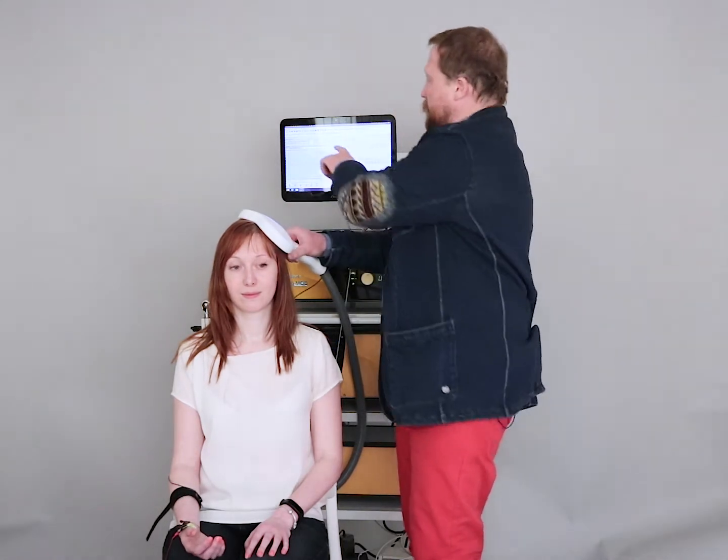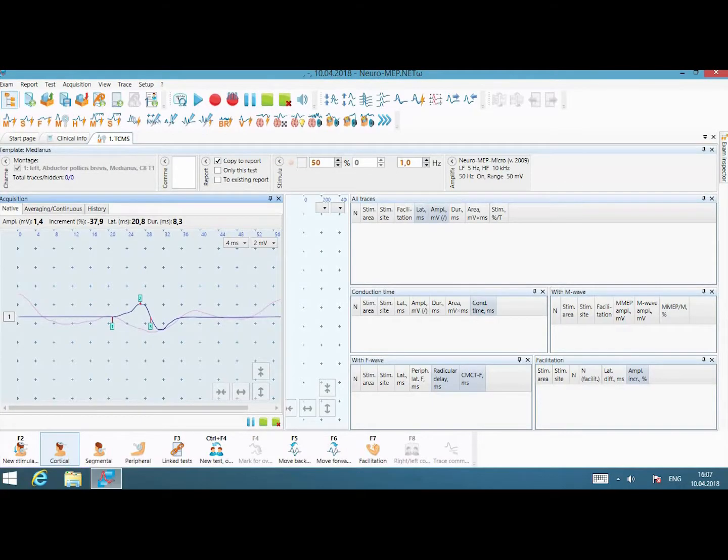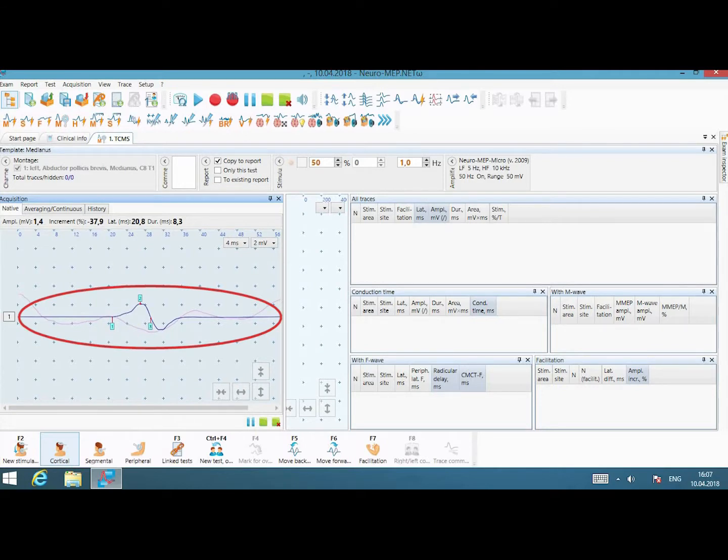So what I see on the screen is called MEP, Motor Evoked Potential.